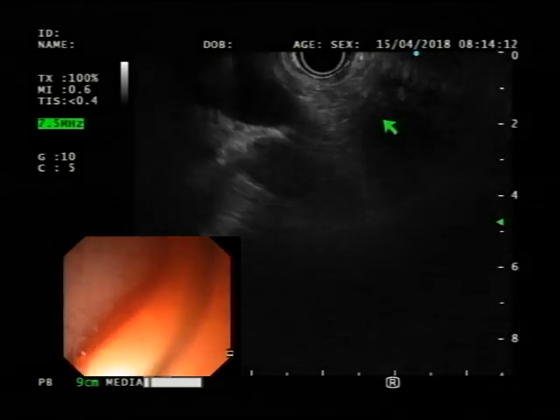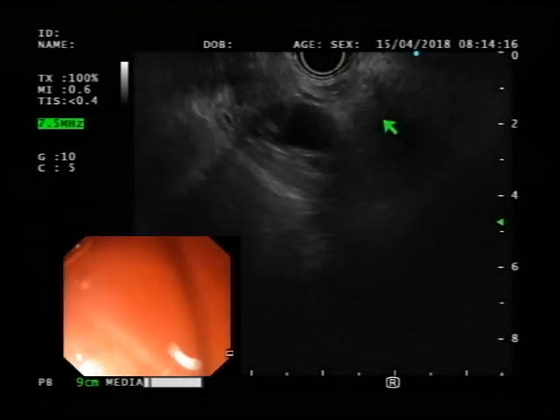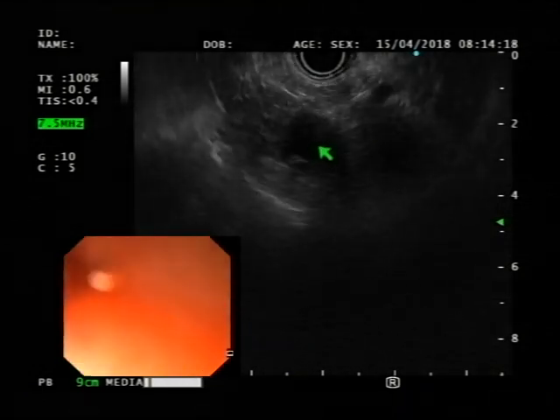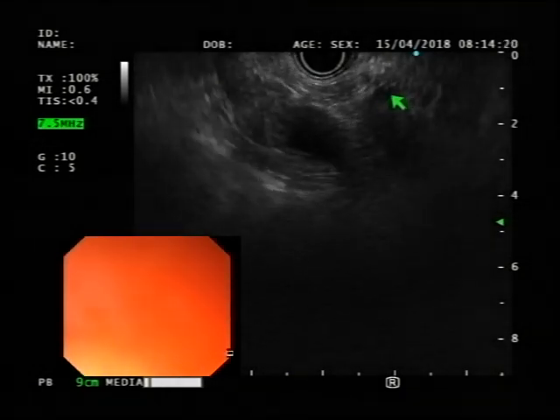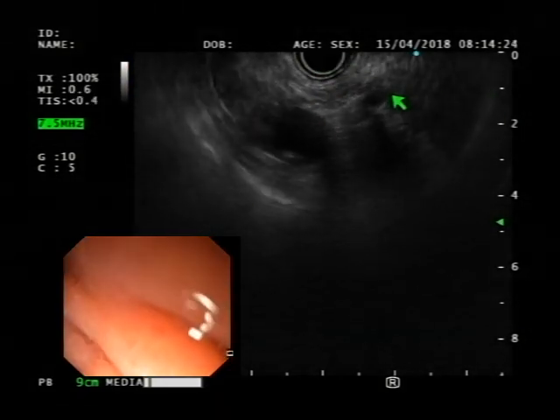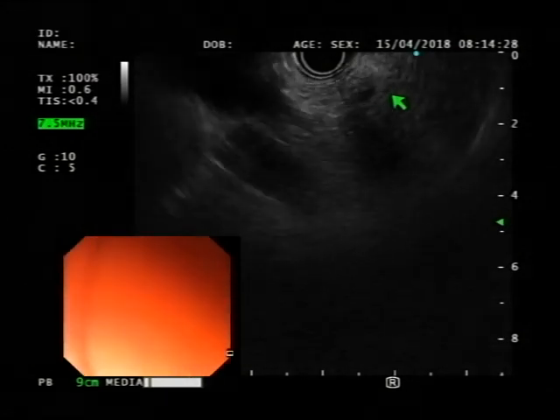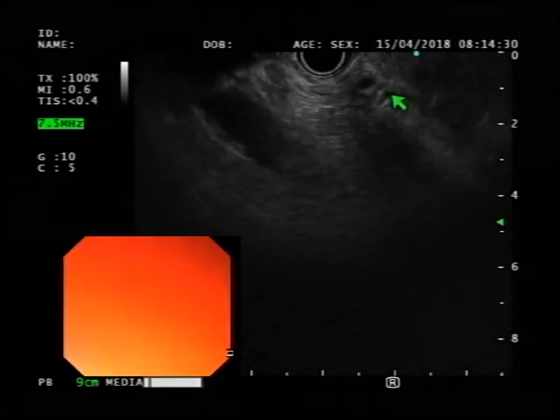Yes. Okay. Big wheel towards you, please. Big wheel towards you before you fall back. You're gonna fall back again. Looks like it. Okay. Here it looks like this is the aorta. And do you see some structure over there? Looks like that's the vein, right? Okay. So rotate it to the right from here. Rotate it to the right. Nice. Right there.